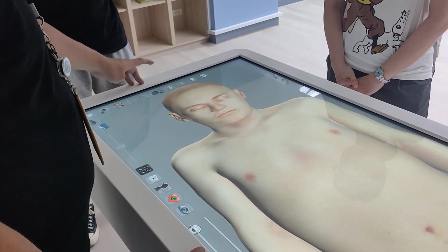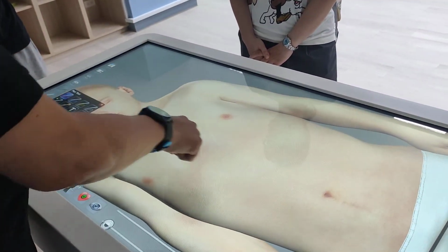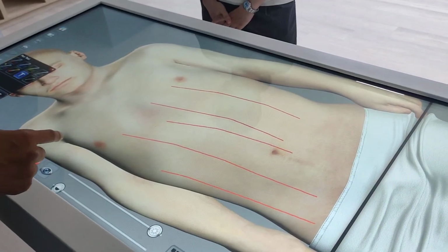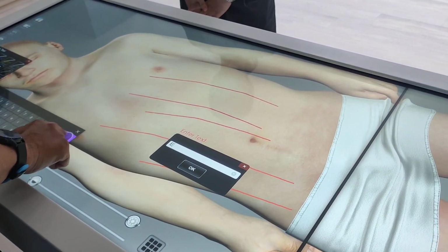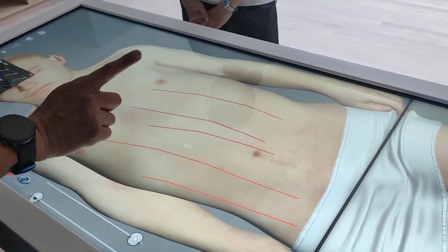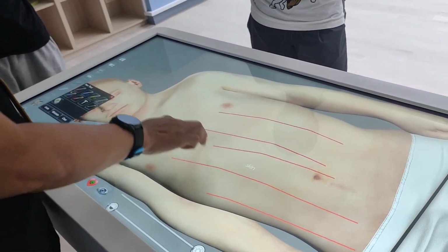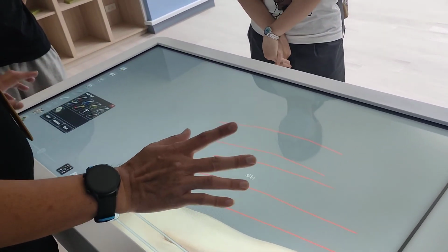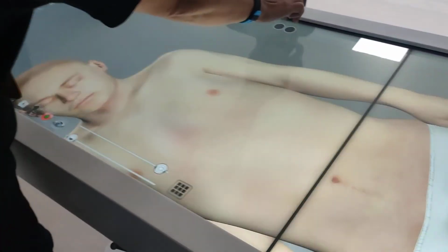All right, and this is the pen, so we can simply draw something here, right? And you can also type. Okay, but one thing is that when you move the cadaver, the word is still here. See? Oh, okay. This is something that I don't think they're doing well. They did not do this very well.